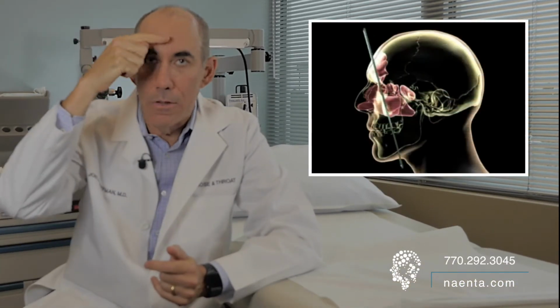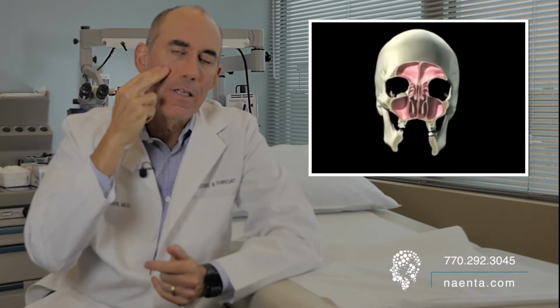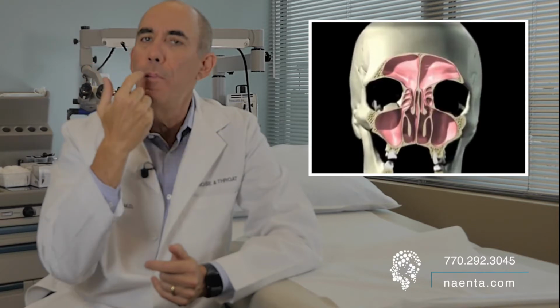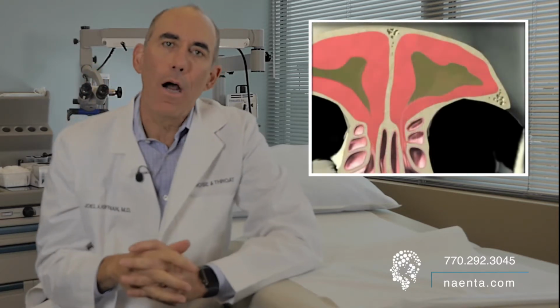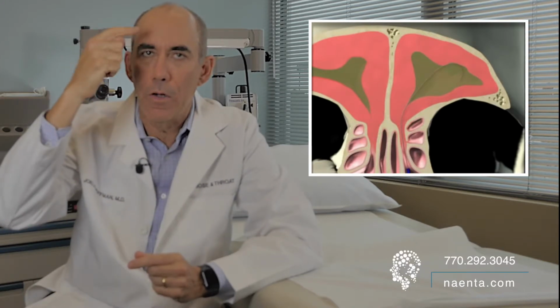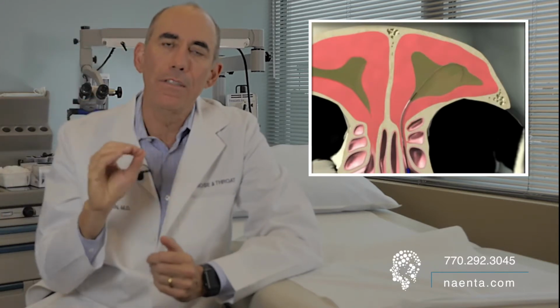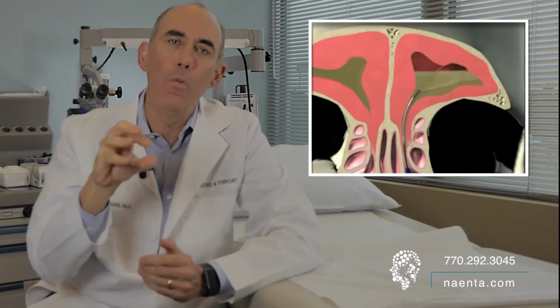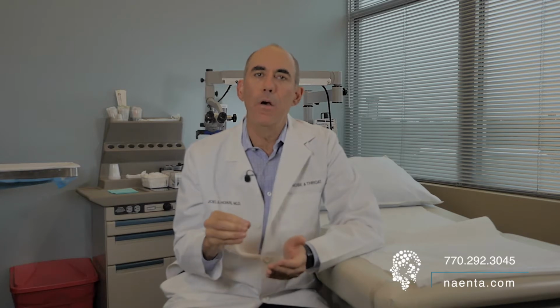The sinuses we work on the most would be the frontal sinus, which is up here, or the maxillary sinus, and then the deep sinus, which is the sphenoid sinus, which is 7 centimeters behind the nose. The guide wire gets passed into the sinus. We can get light confirmation to make sure we're in the correct place. Then the balloon gets advanced into the drainage port, and it microfractures the bone, which will keep it in the open position. The anesthetic part of the procedure, numbing up the nose, takes longer than the balloon sinuplasty itself.